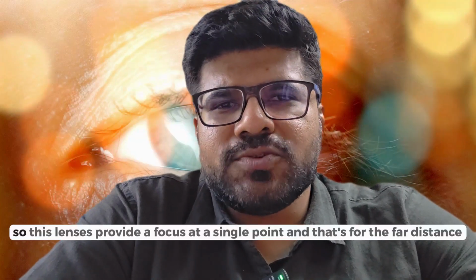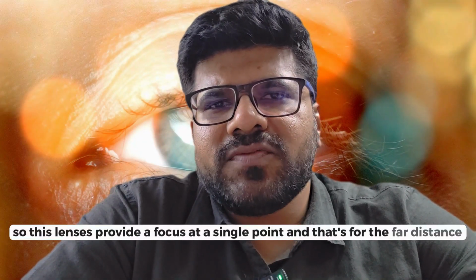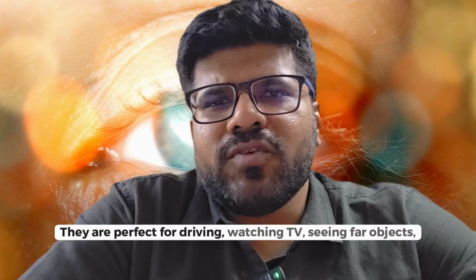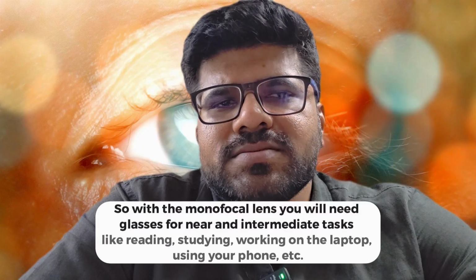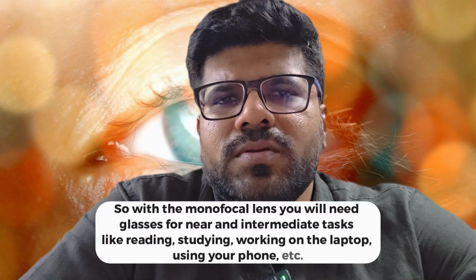Mono means one, so these lenses provide a focus at a single point, and that's for the far distance. These are the most commonly used lenses in clinical practice. They are perfect for driving, watching TV, seeing far objects. So with the monofocal lens, you will need glasses for near and intermediate tasks like reading, studying, working on the laptop, using your phone, etc.